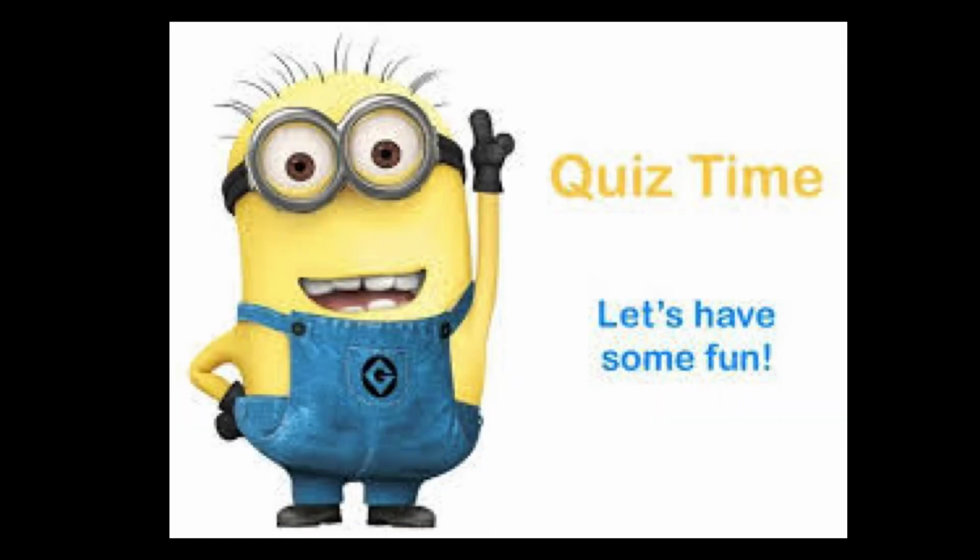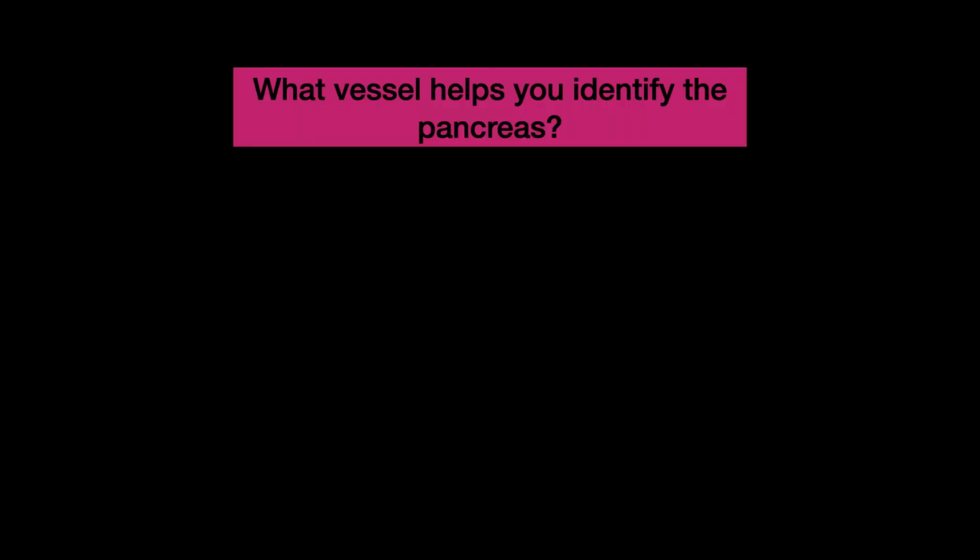Now let's take a short quiz about a right upper quadrant scan. After the question, you will have 3 seconds before the answer will appear on the screen. What vessel helps you identify the pancreas?